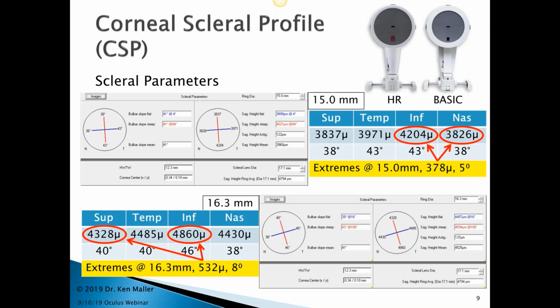Obviously, you're locked into the entire quadrant. The advantage that wave gives you is you're not locked into any particular quadrant whatsoever. And so I can do all of that asymmetry 360 degrees around the lens.